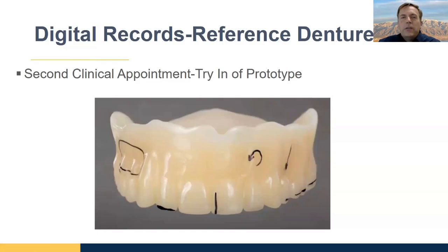Here we have a good question. Does 3Shape exocad allow for changing the denture base thickness to accommodate a locator housing pickup, or will the proposal dictate the denture base thickness? If you're doing the digital locator workflow with the scan body, the scan body housing becomes the model, so the software will offset from the model.